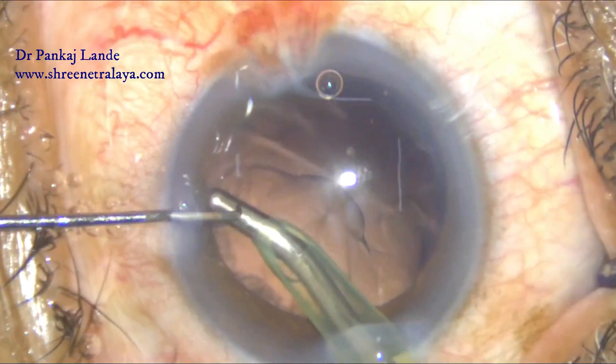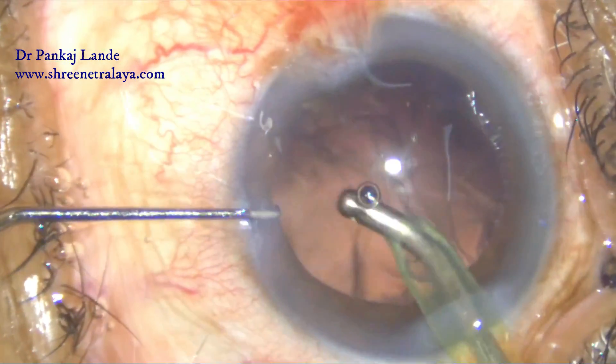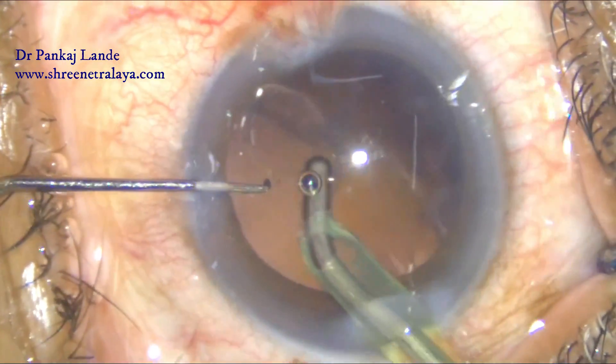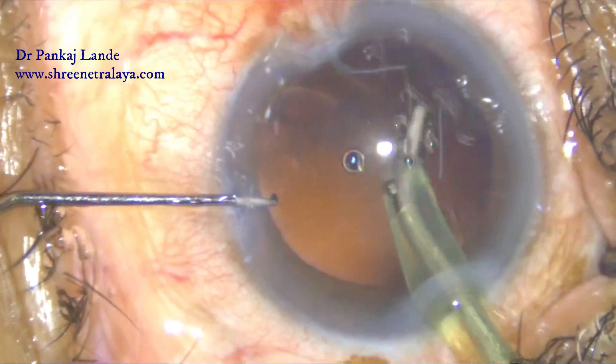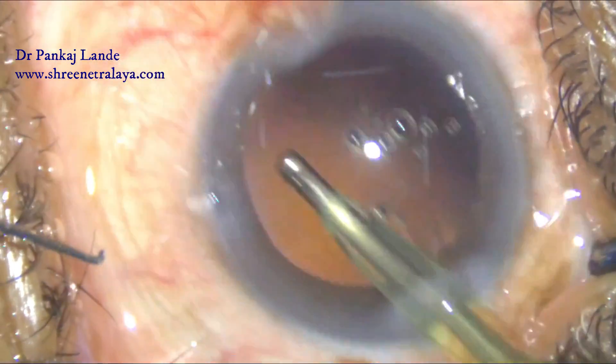The pre-chopper has helped me a lot in this scenario. Once the nucleus is fully emulsified, the cortical matter is removed with the help of a coaxial IA probe and a foldable IOL is implanted in the bag.